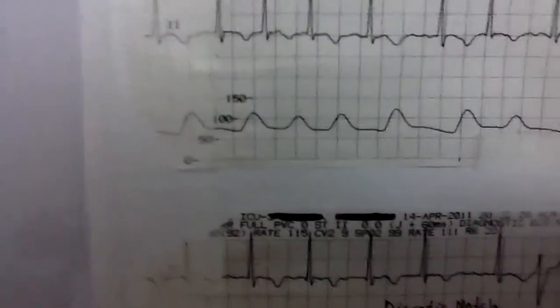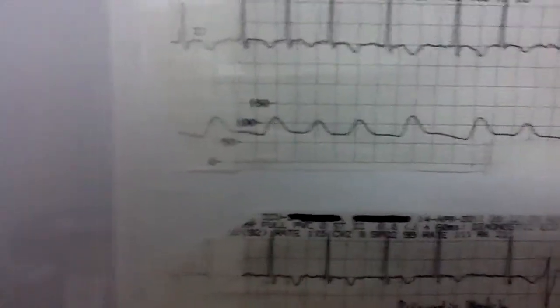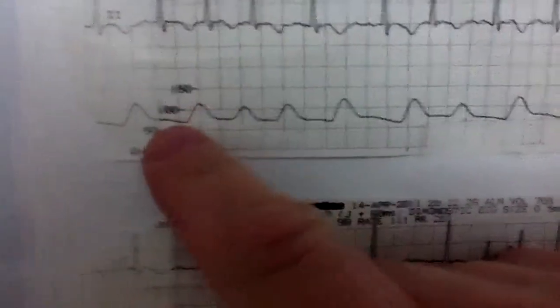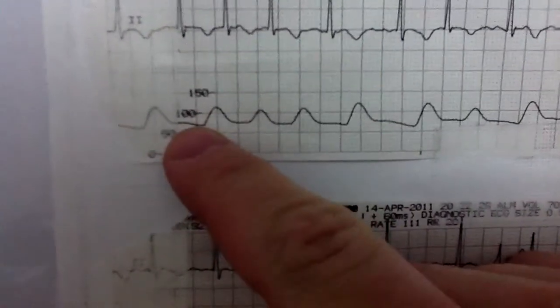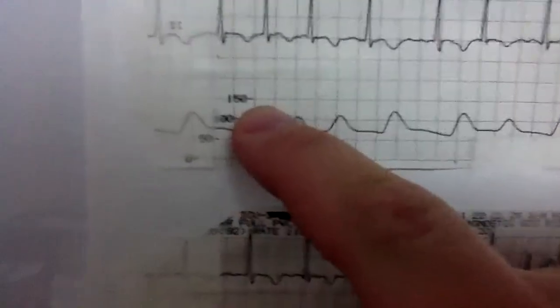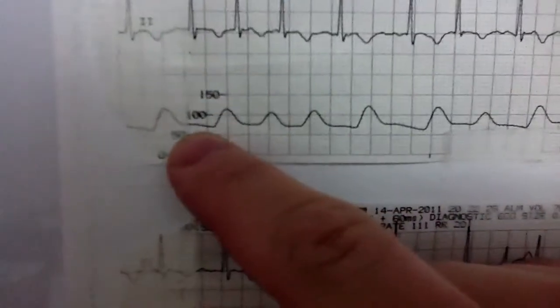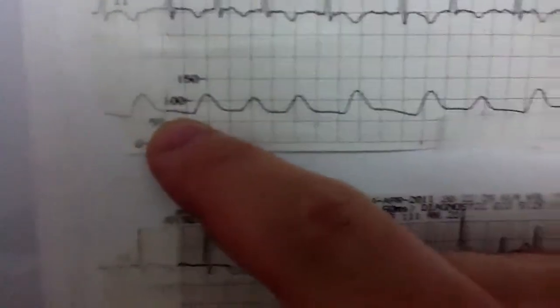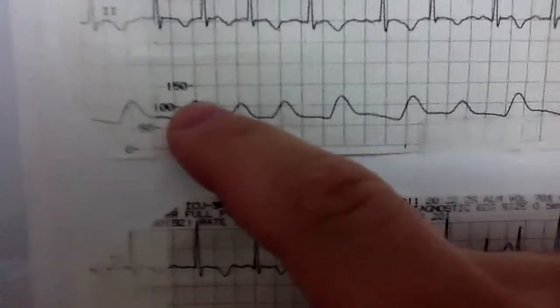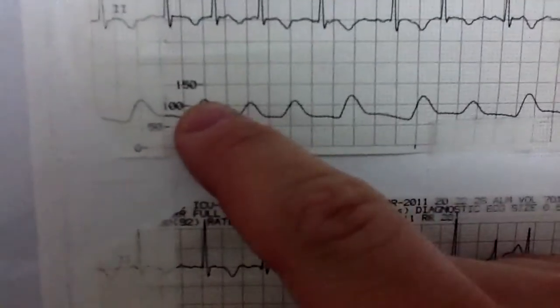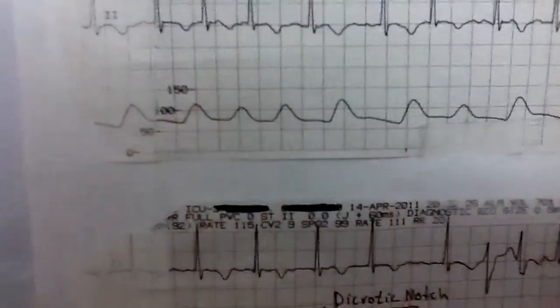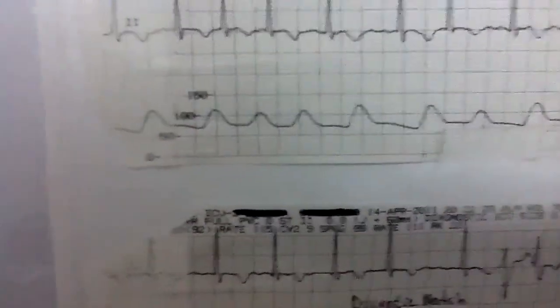You just kind of get this rounded waveform — not uncommon to see in a lot of these waveforms. The lowest point here would be diastole with the highest point being systole. We're looking at about 75 for diastole and maybe 125 or so for systole.